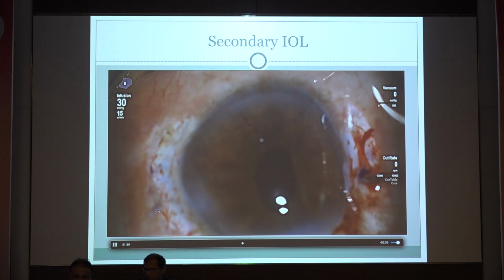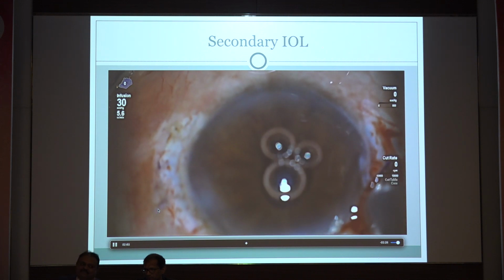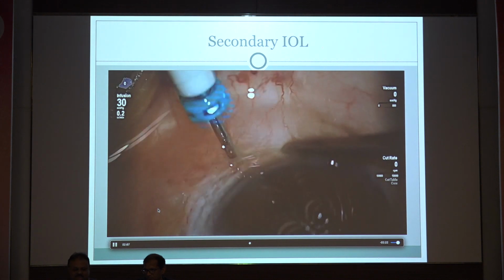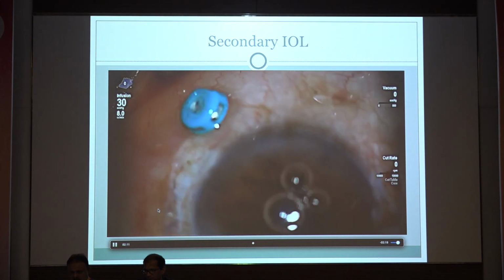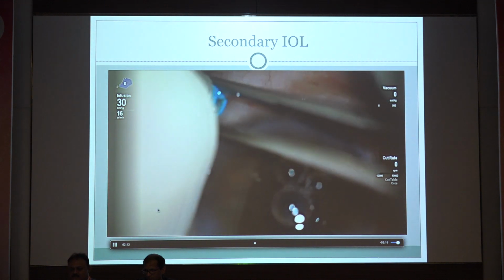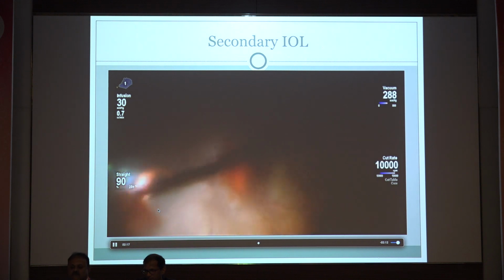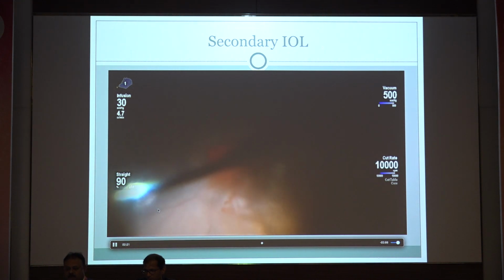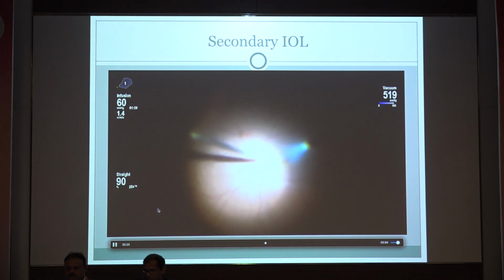So I had no other option. I had to do a vitrectomy to remove the haptic. A 25 gauge entry was made through the existing scleral wound, as it was such a hypotony that I could not take any other port. As soon as I entered the vitreous cavity, I saw vitreous hemorrhage. So a thorough vitrectomy was done. PVD induced.